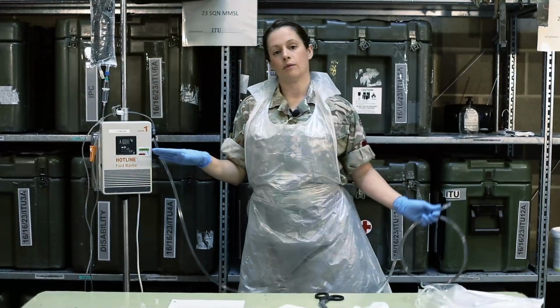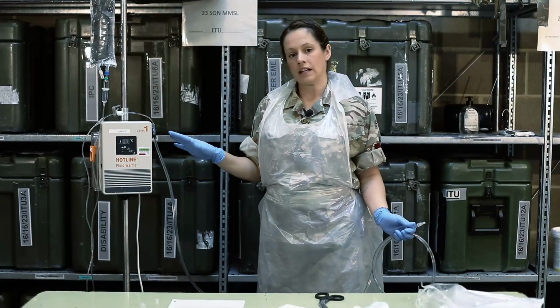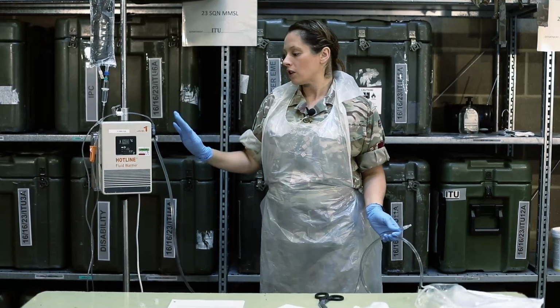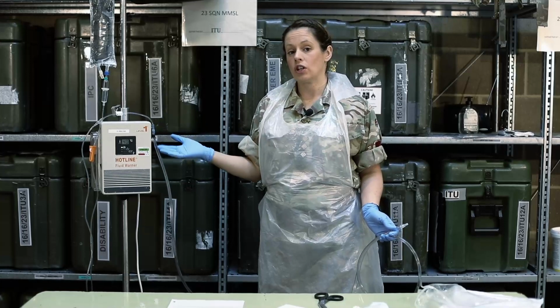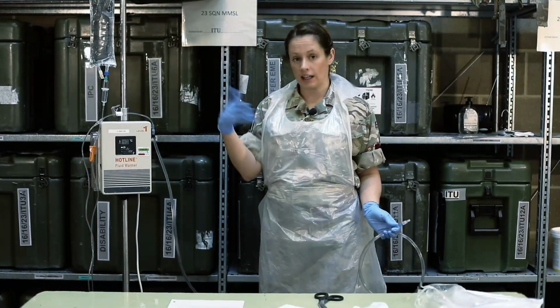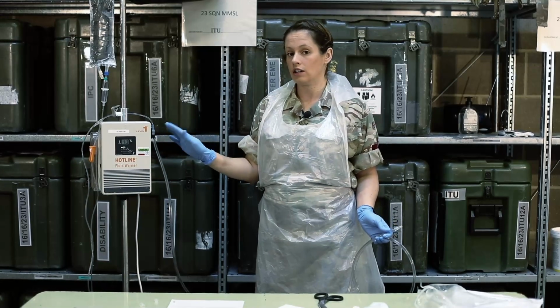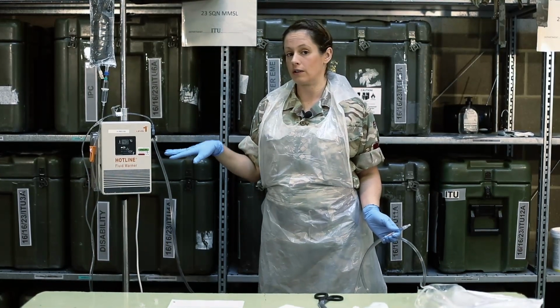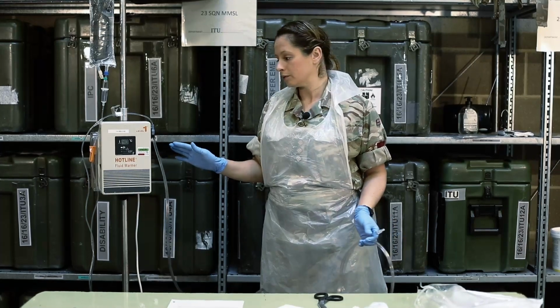So we're just getting up to temperature at 40 degrees. This will be safe enough to give to our patients, but we might as well wait until it gets to 41. Also, when it does get to 41, the machine will stop circulating, and when the temperature dips, it'll then kick back in. So you might hear that the Hotline stops circulating fluid around the giving set, but that's completely normal.